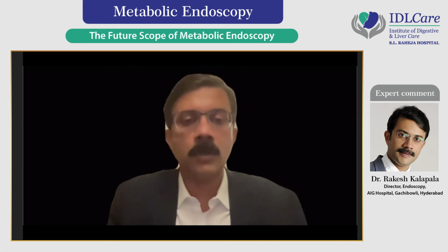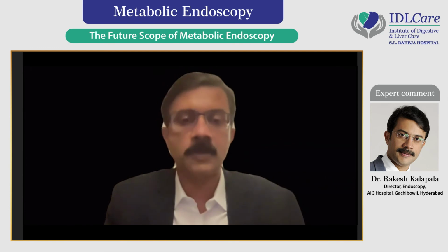First, coming to the balloons, as we all know, the Orbera balloon is the one which we all used of late till now, but now the new adjustable intragastric balloon is one thing which I look upon and we regularly practice. One is because our stomachs are not as big as the Western stomachs, and so the tolerability of the balloon is not that easy. So once you have the adjustable balloon in hand, then probably you can increase or decrease the volume according to the need of the patient. So that's one thing from the balloons perspective which we look forward to, and that will be very handy in managing the patients of standalone obesity.